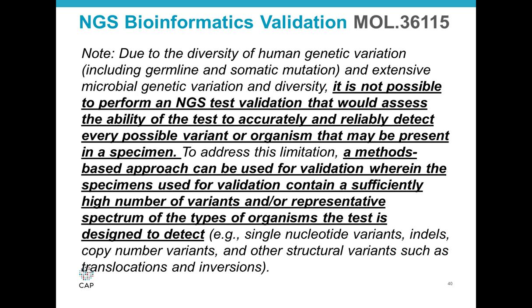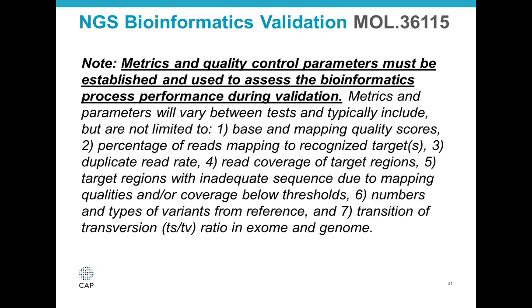A methods-based approach can also be used for the analytical bioinformatics process validation, using a sufficiently high number of variants that the test is designed to detect, such as single nucleotide variants, insertions and deletions, copy number variants, as well as other structural variants such as translocations and inversions.